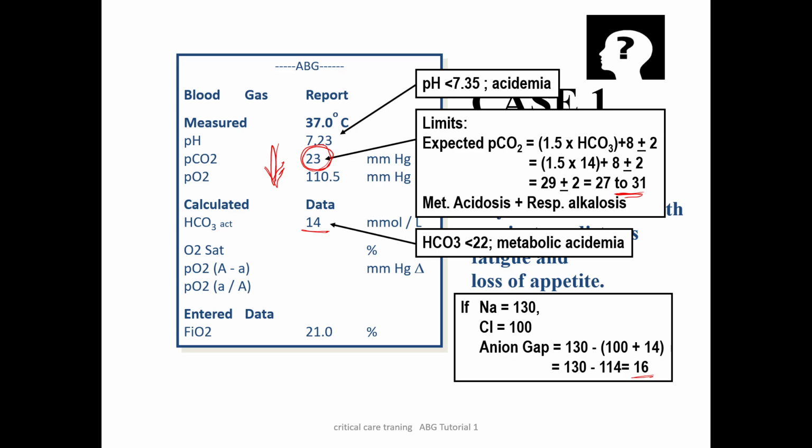The underlying condition is diabetes. We have to check for uremia and renal function. We have to check the blood sugar level. We have to rule out diabetic ketoacidosis in this condition. And he is washing out CO2, the additional respiratory alkalosis, because of sepsis or an underlying infection. So this is how, in clinical context, the ABG helps us to approach and calculate the situation.